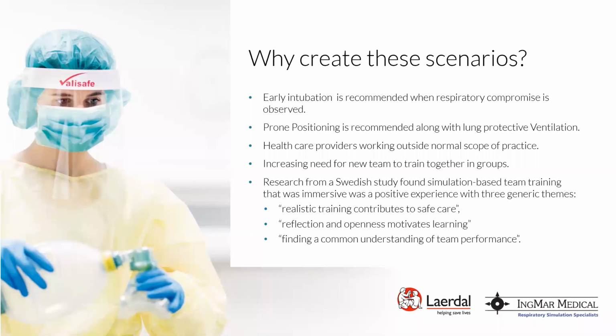Another recommendation for these patients is to prone the patients and follow a lung protective ventilation strategy. This is also known as ARDS-NET protocol. When the patients progress into severe ARDS, this is what we would do. Keep in mind, the information is constantly changing, and this could be recommended earlier in the progression of this disease as we learn more about COVID-19.